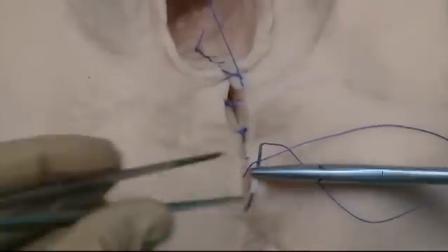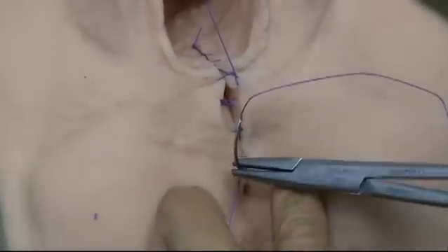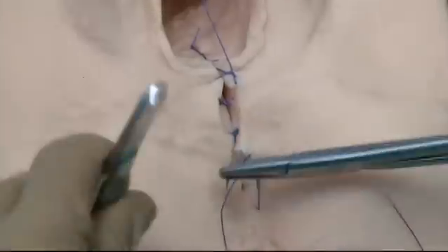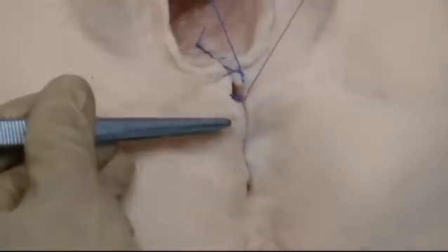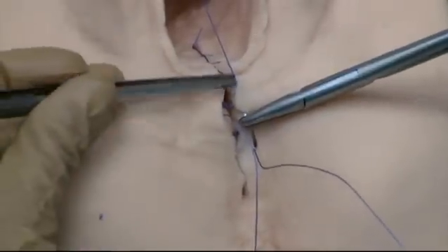The subcuticular stitch is just taking about a millimeter underneath the epithelial layer and bringing those together — it's more of a horizontal stitch, perpendicular to the perineum. When I go in on the second stitch it's exactly where I came out on the other side, so you don't get a zigzagging appearance. The needle goes in right opposite where I came out, not behind it. You need to be careful of the cutting needle — if it hits any of that suture material it may actually slash it, so be very careful not to hit any suture material because that will break down the whole repair.